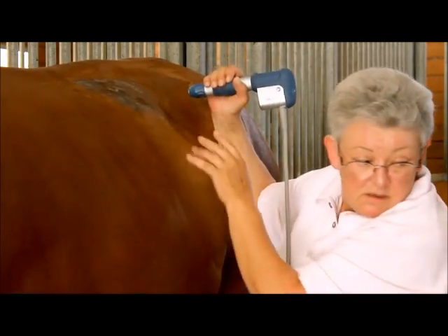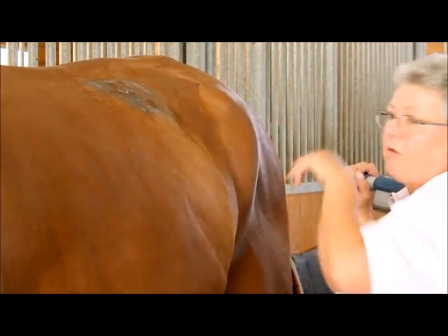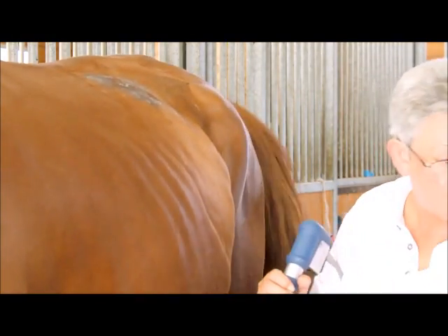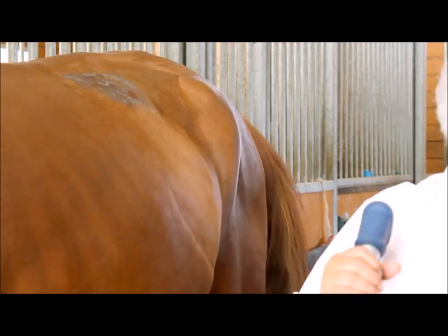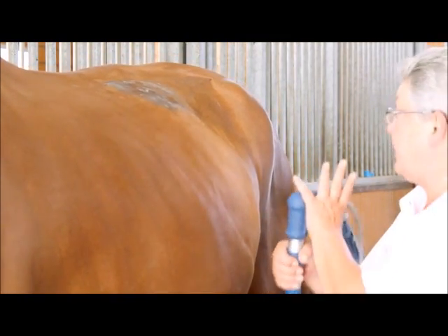How many minutes do you take to install and prepare the system in the stable? Five minutes. Five minutes from the car to the horse? Depends on how far away it is. It's easy to handle.